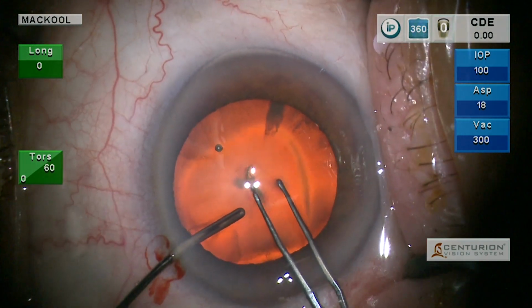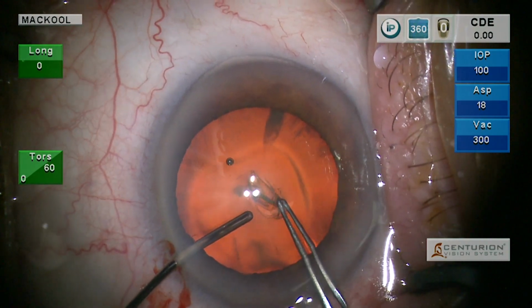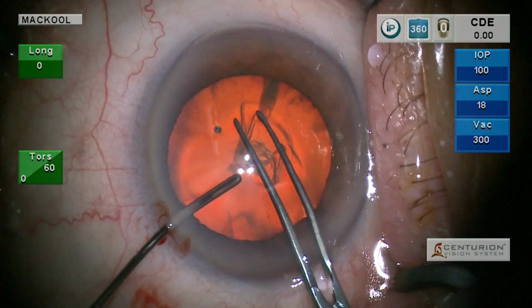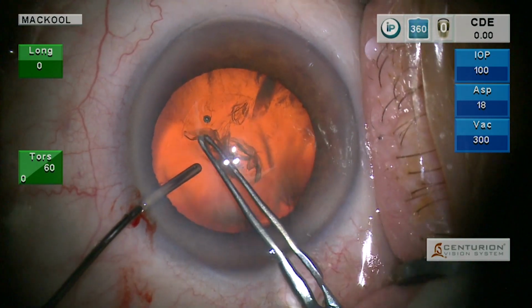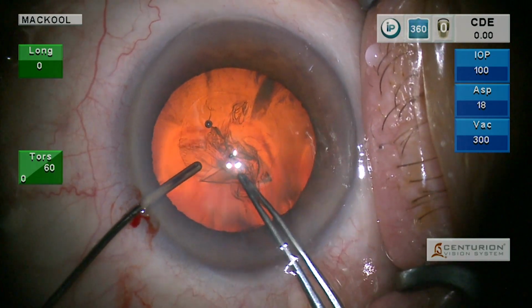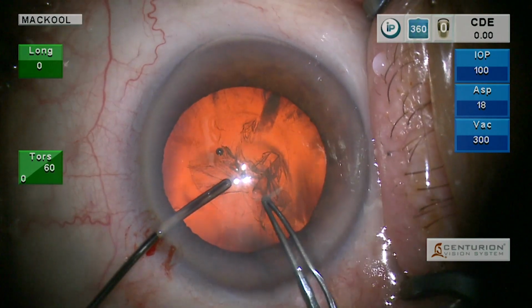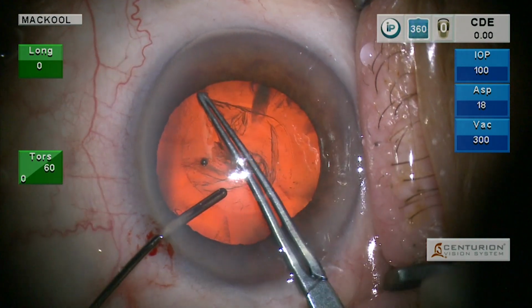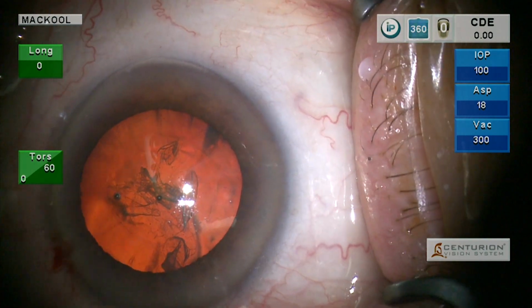So, setting yourself up to succeed, kind of an important surgical principle. And by that I meant, what do we have to do here? We had to get this globe into position where our visibility was excellent. Okay, so now we do the capsulorhexis, and I'm going around in a counterclockwise direction, following the curvature of the pupil.